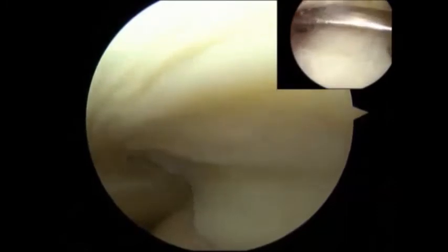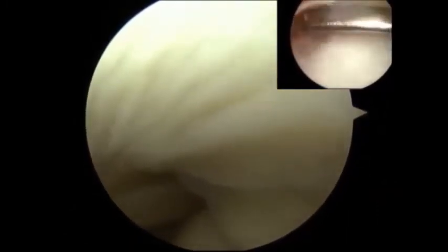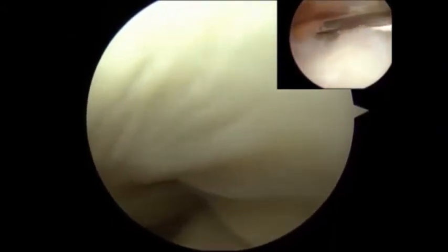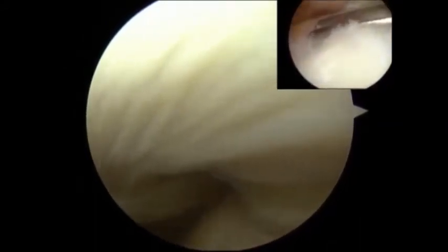To illustrate the point of having two cameras, we're showing a suture passer from both sides. From the subacromial camera shown on the top right, it appears that an adequate bite is being taken, but the intra-articular camera shown on the bottom shows otherwise. The deepest layer of the cuff may be missed.